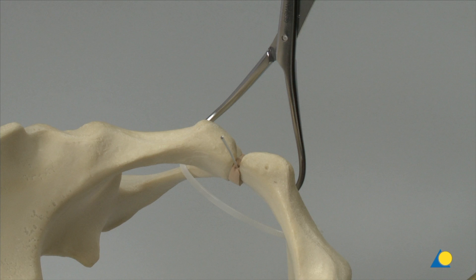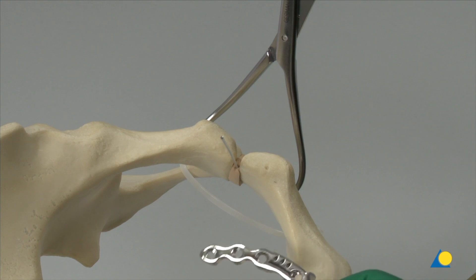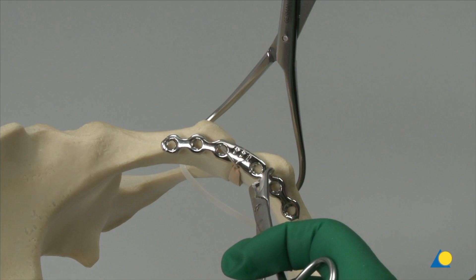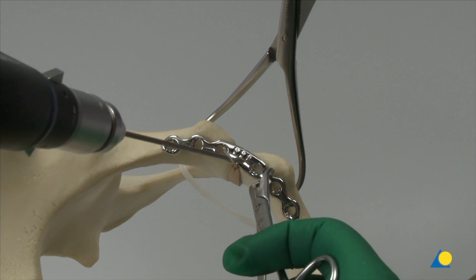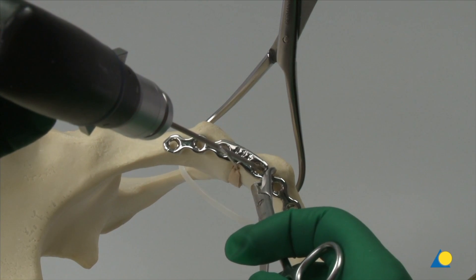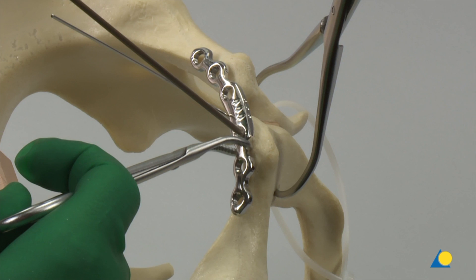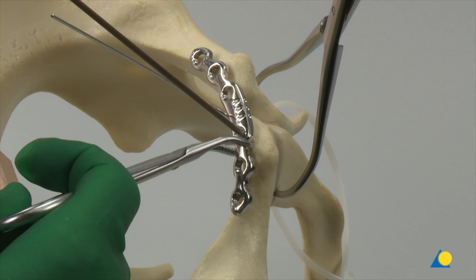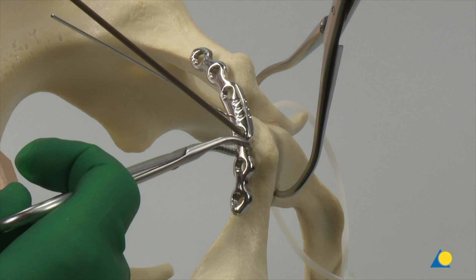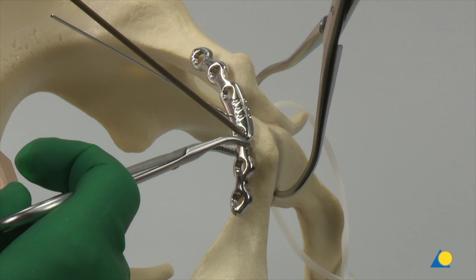A K-wire is used to define the midline of the symphysis. Position a 6-hole 3.5 symphysial plate centered over the symphysis and posterior to the rectus abdominis muscle insertions. Insert the first plate screw close to the symphysis. The direction of the screw in the sagittal plane is given by the oblique orientation of the pubic body. In the frontal plane, it is directed slightly divergent. Palpation of the posterior aspect of the pubic body helps the spatial orientation of the drill bit.